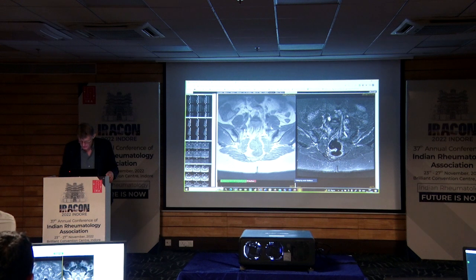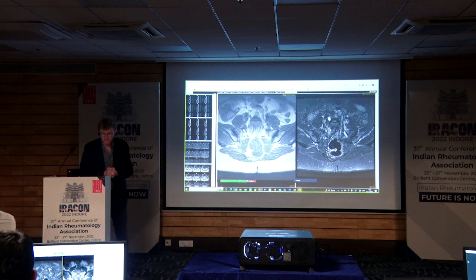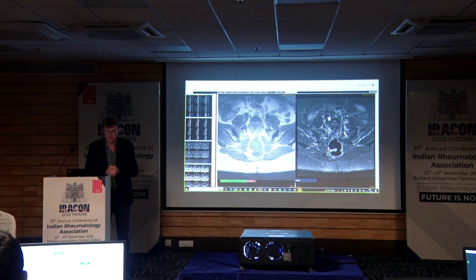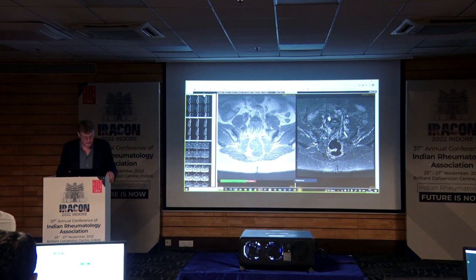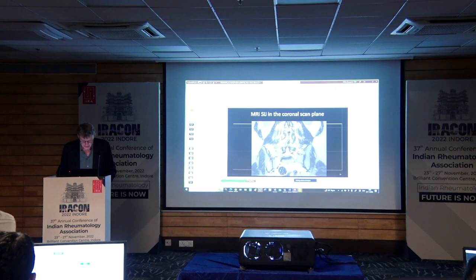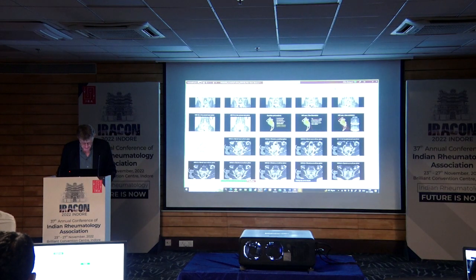Yes, with that I think I would suggest that we move on to talk a little bit about the spine. Are there any sacroiliac joint questions here before we move to that? Right, then I'll move into that. We could have spent several days on this, probably you would fall asleep before that, but you principally could, and because I think it's quite interesting, fortunately.